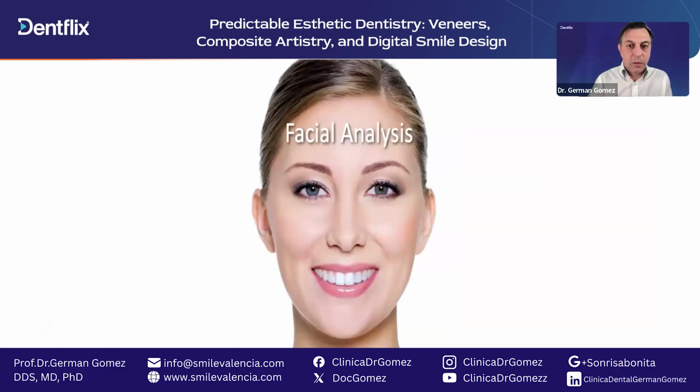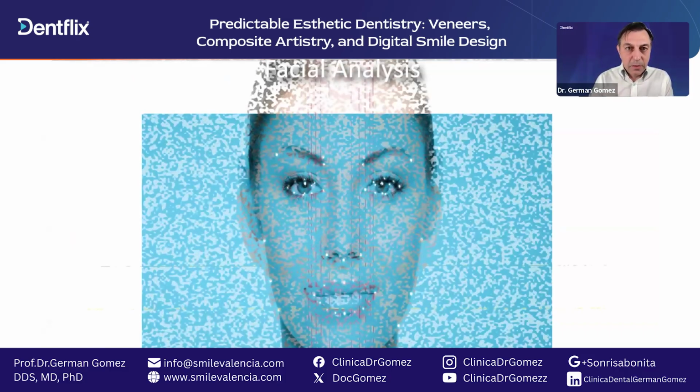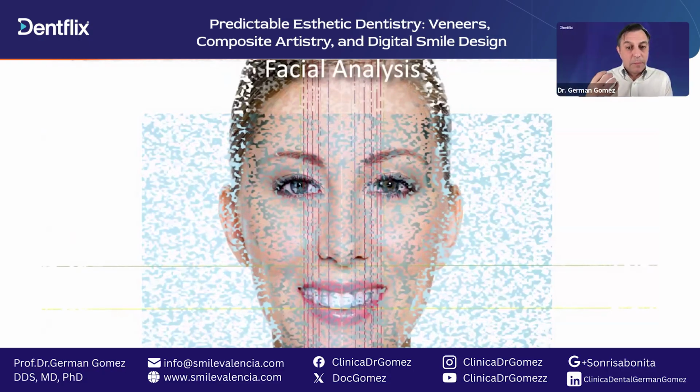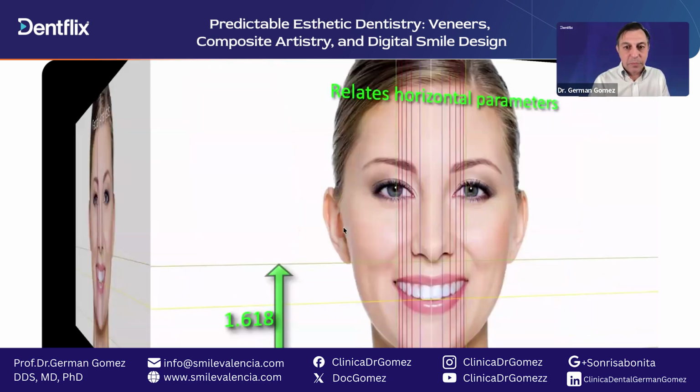Now we analyze the smile. We can use digital programs to analyze the smile digitally, or we can analyze it by ourselves. You see here, for example, this eye is way more in than this eye from the midline.